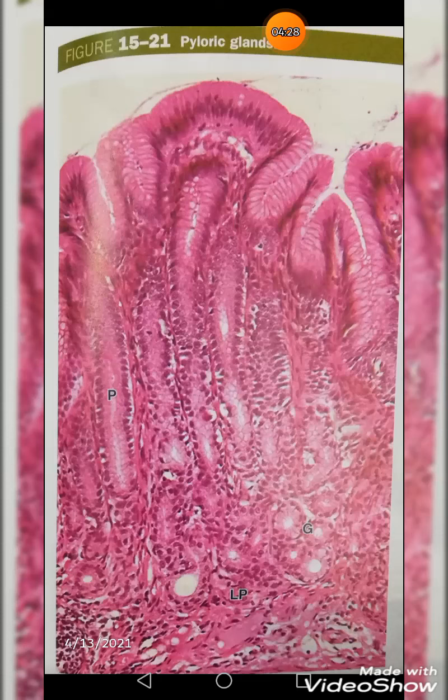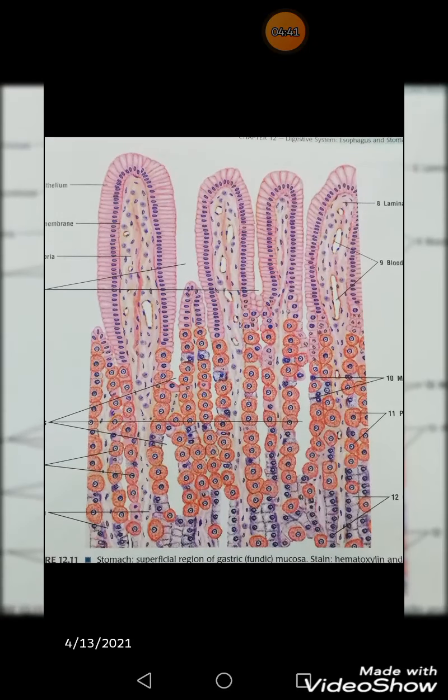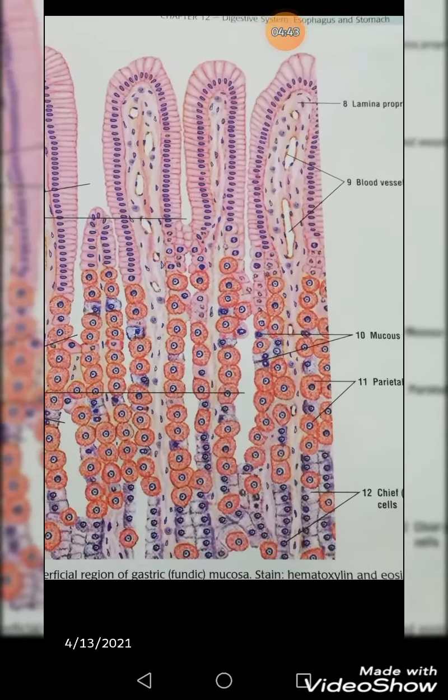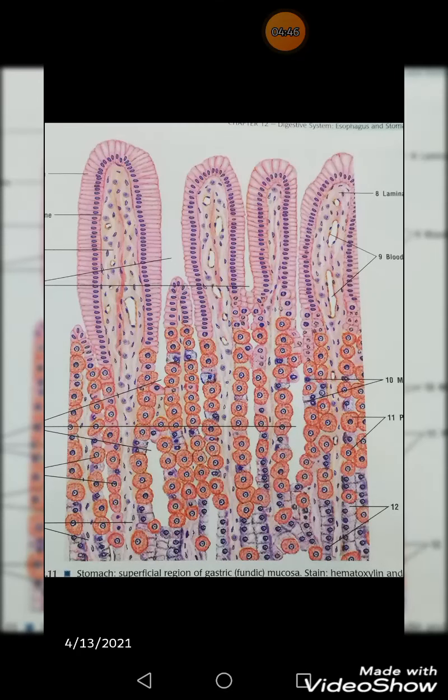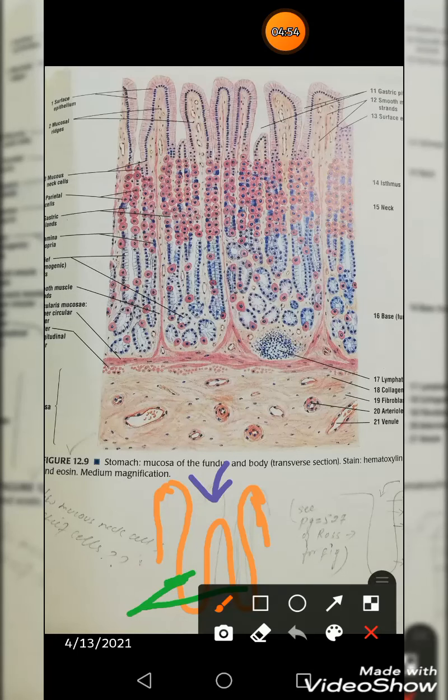Now we are interested in various histological patterns. These are pyloric glands. You can see their pits and the bases. In this schematic diagram, the very marked reddish cells are parietal cells, through which you can easily recognize that this is the slide of the stomach. Again, in this schematic picture, I would rather show you the shape of the gland so that you can see where the glands lie. Roughly, I can draw that this is the simple branched tubular gland that is marked below as well.